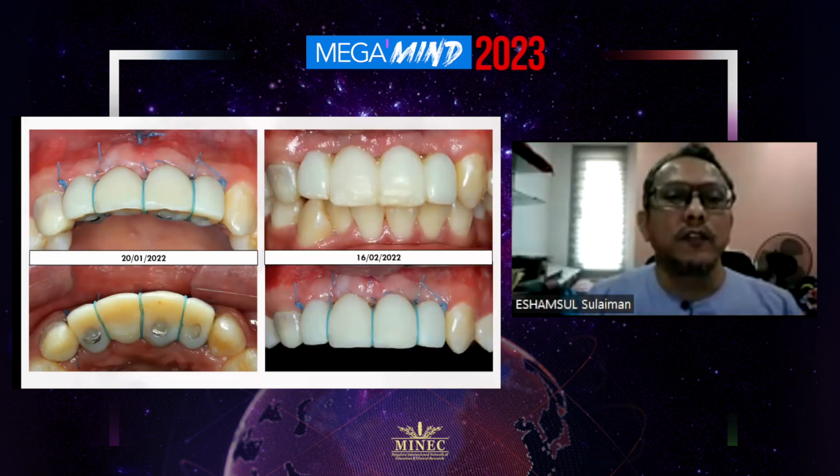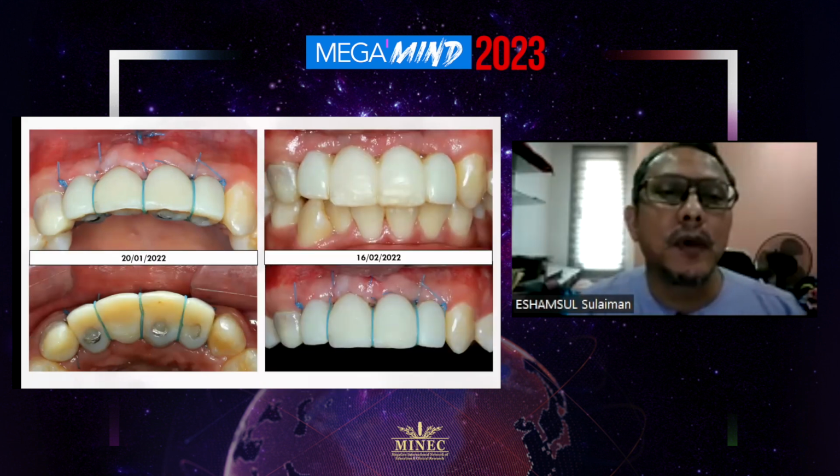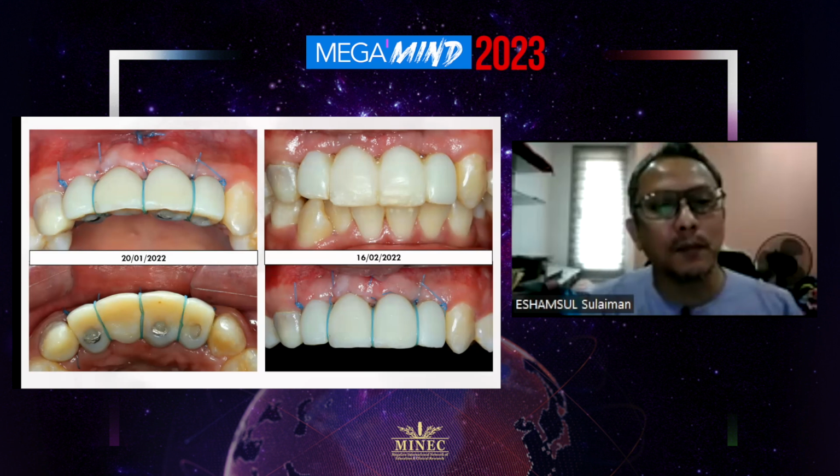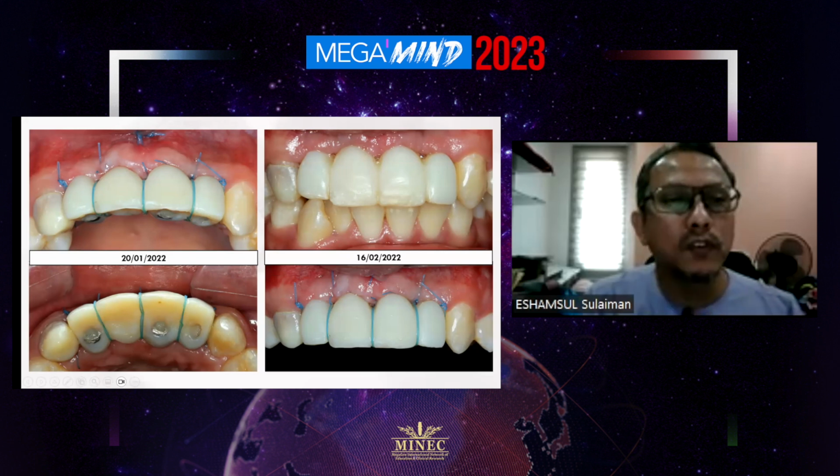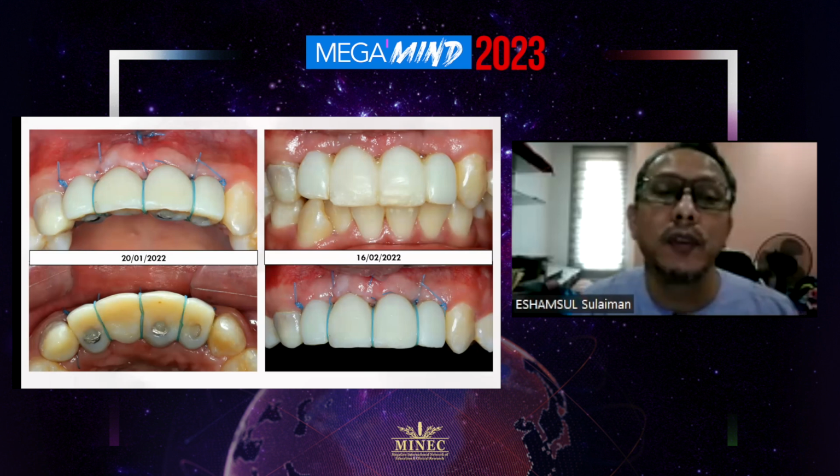So here you can see the healing, approximately about 10 days. It's a bit earlier, but because we were rushing for the patients to get engaged. So this is the review at about 10 days. You can see the good mature formations of the keratinized tissue on the labial aspects of the implant and the pontic. And here, about 1 month later, the maturation of soft tissue.